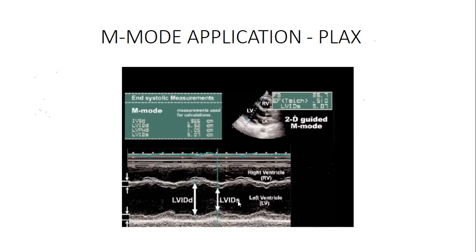Are we together? Yes, we are. In systole. So when you find these figures or these abbreviations, they should not scare you. Know what this S is standing for, know what this D is standing for, and know the parameters and where you are measuring.